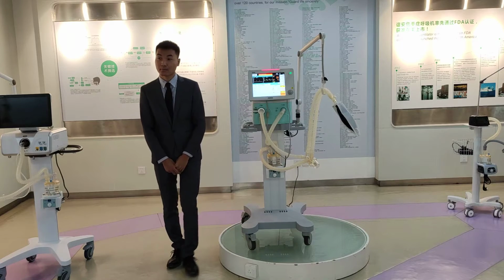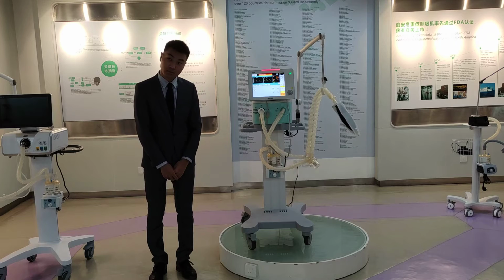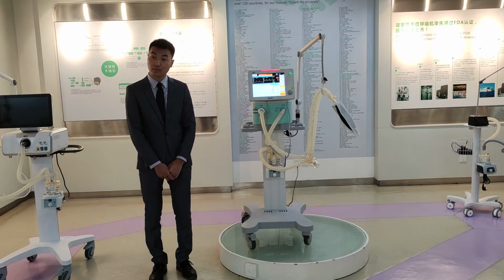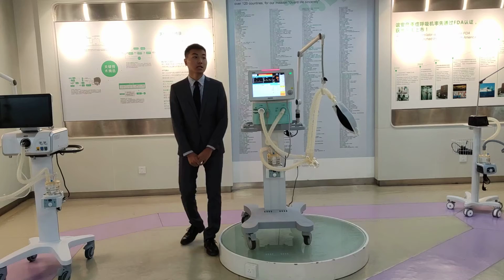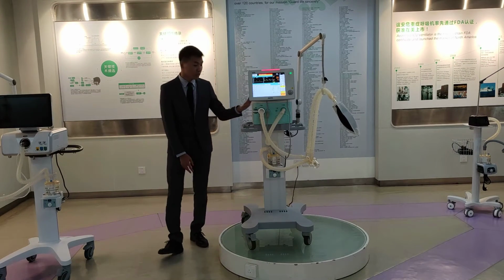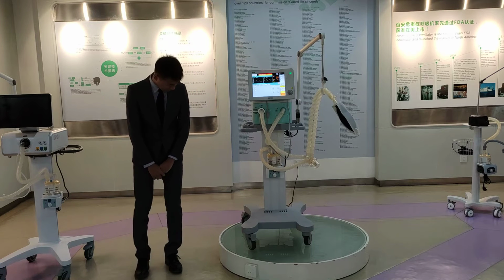As you mentioned, this machine can be used in the ICU. What's the advantage compared with a ventilator with an air compressor? The ventilator with the air compressor is the classic.